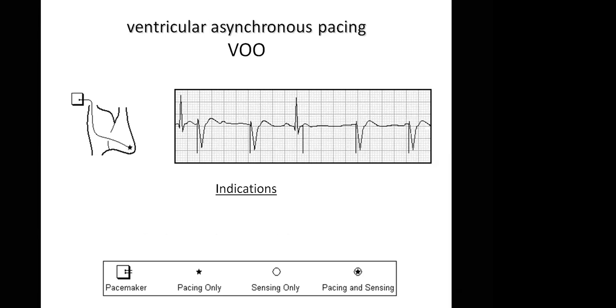Okay. So let's start solving some questions. Dr. Dudu Yemi, we'll start with you. You can see this, right? Yes, sir. So what mode, and justify the mode? Even if you can see the name of the mode, justify the mode. Okay, it's pacing the ventricle. We can see the pacing spike at the ventricle. So that's the first letter. The second letter means it's not sensing anyone.